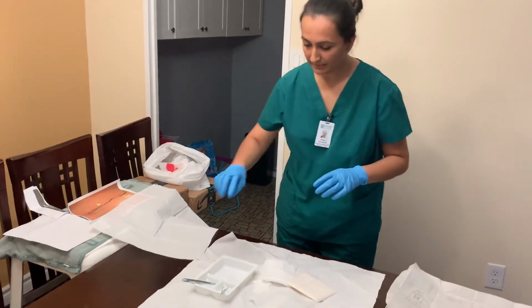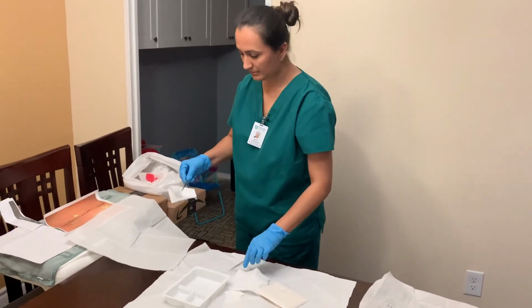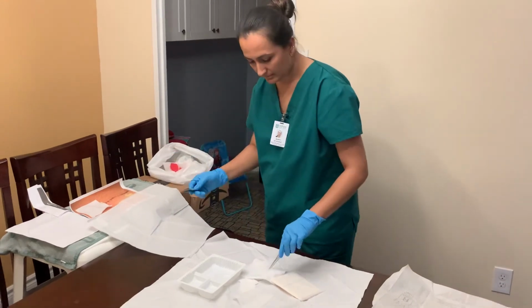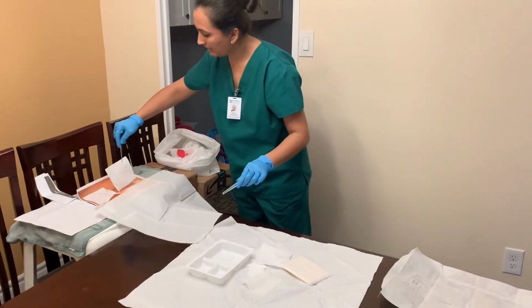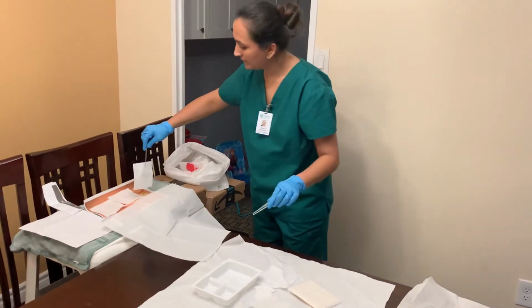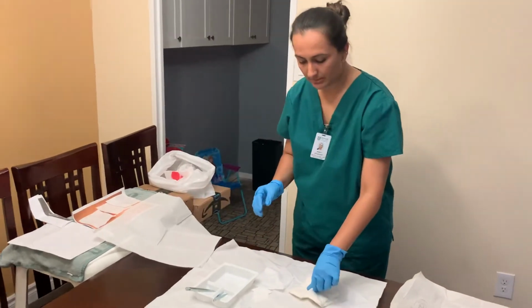Okay, so yes, I'm going to put a 4 by 4. So we're just going to put the 4 by 4, and then this abdominal pad.